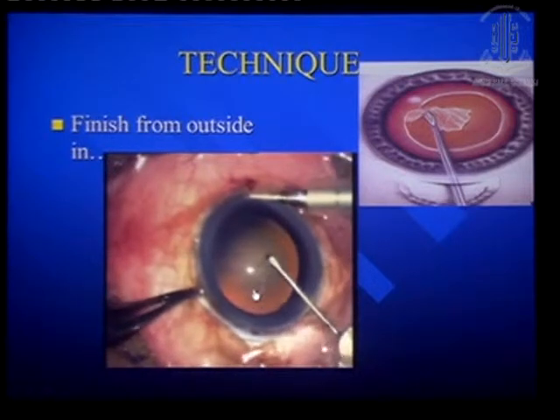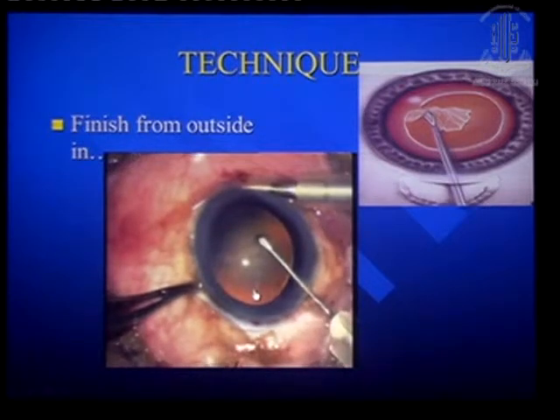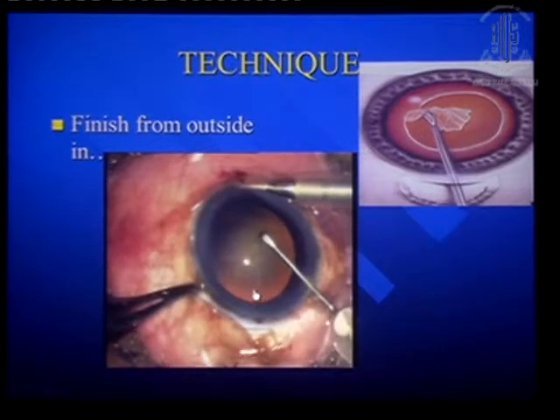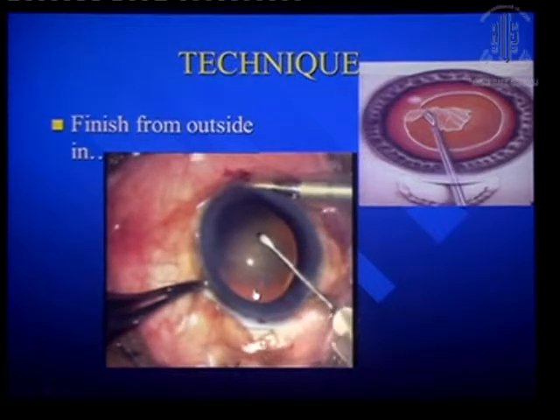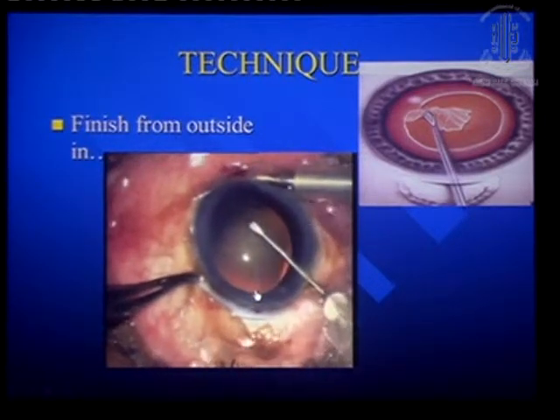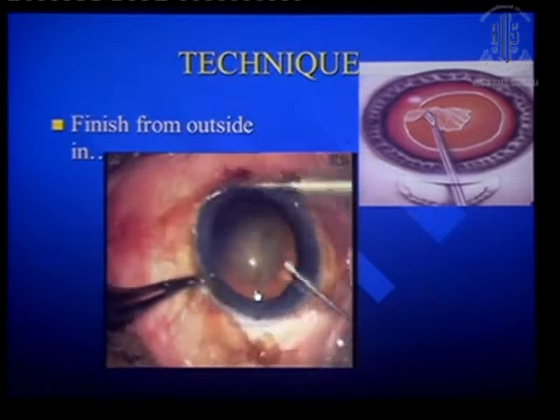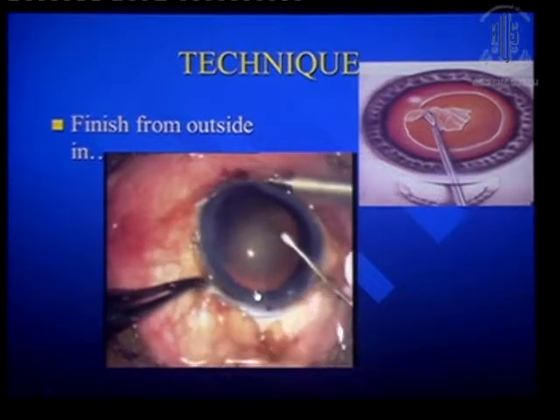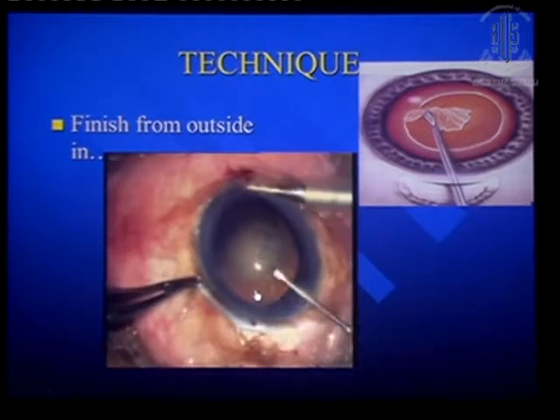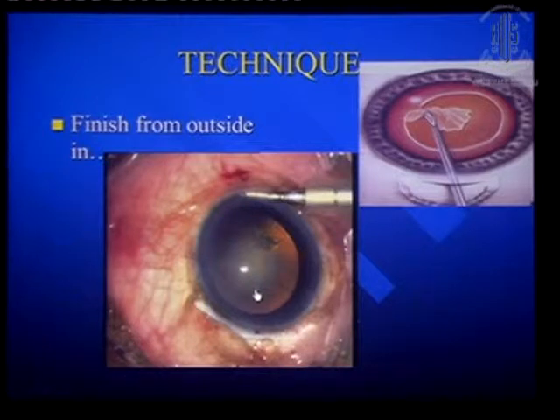I am doing this under hydro with no viscoelastic at all — so this is what I want to show you. It slips whenever you catch it because of the hydro pressure, but that is the base pressure where you can go for the REXIS. Once you do that, after that you can just rotate, and you can very clearly complete the REXIS just by using the AC maintainer only.